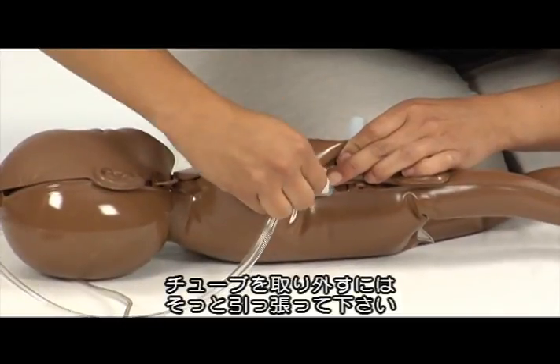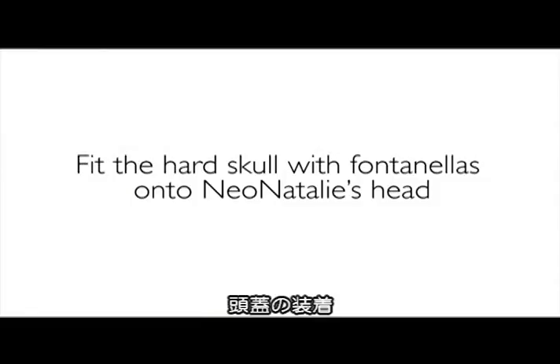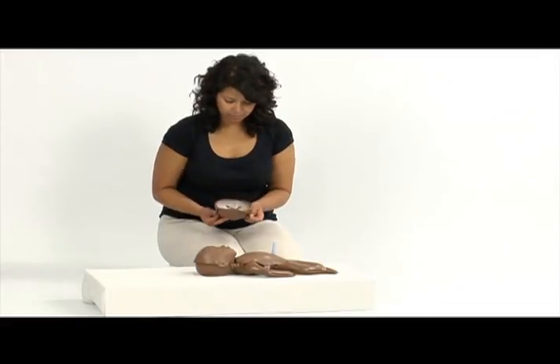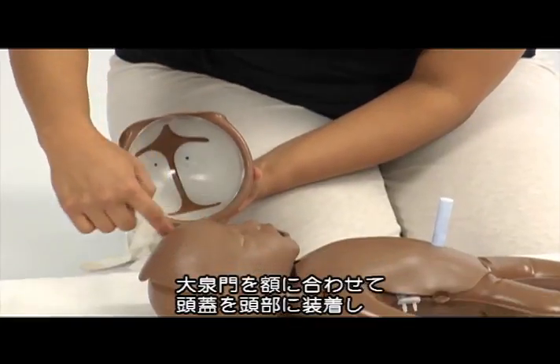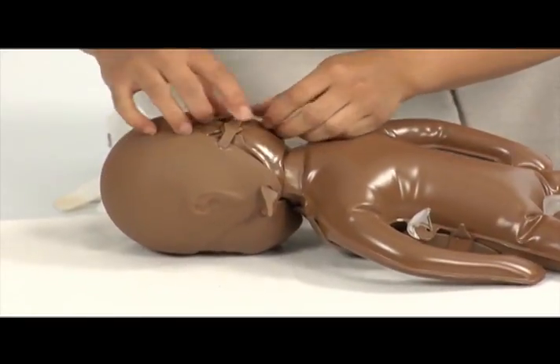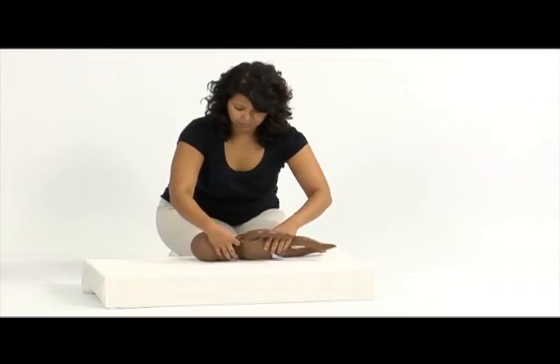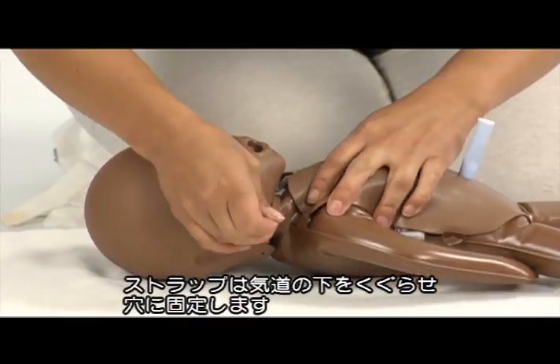To detach the simulation tubes, pull gently on the tubes to release them. Fold the sides of the hard skull upwards. Place the skull with the triangular frontal fontanelle on the forehead. Unfold the sides of the hard skull downwards to cover the ears. Tighten the back side of the skull by pulling the strap. Feed it under the airways and secure through the small hole on the other side.